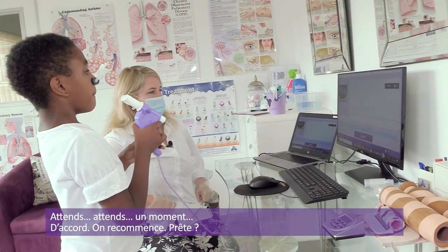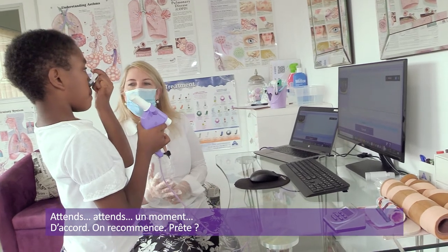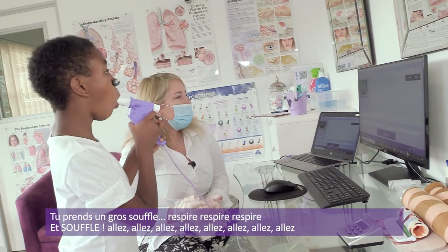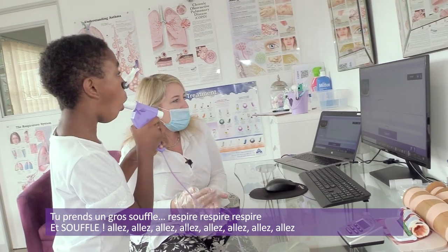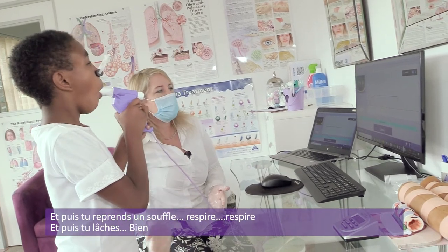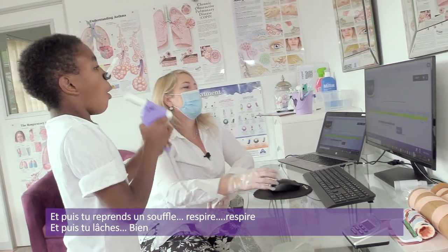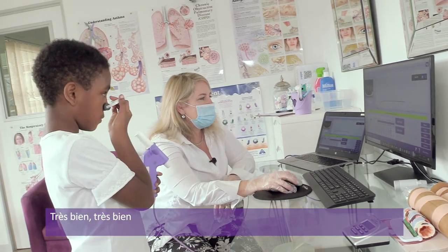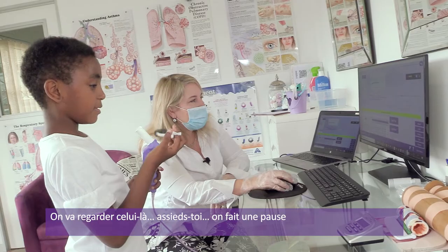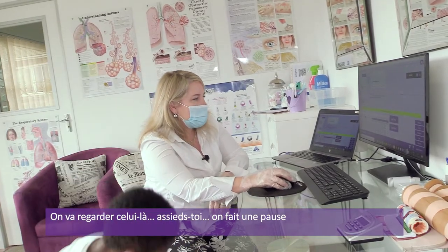Wait. Just hold on a second. All right. Okay, let's start again. You ready? Okay, big one. And fast. And breathe in to the top. Good. And rest. Very nice. Okay. Let's have a look at that one. Take a seat. Just take a break.